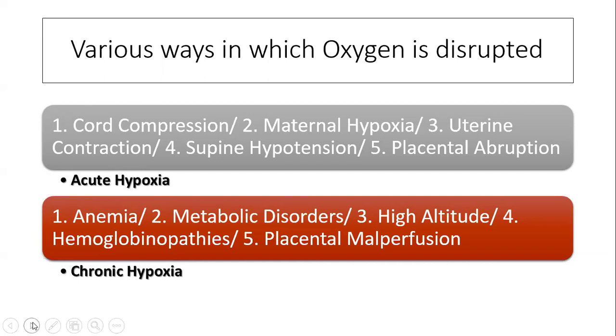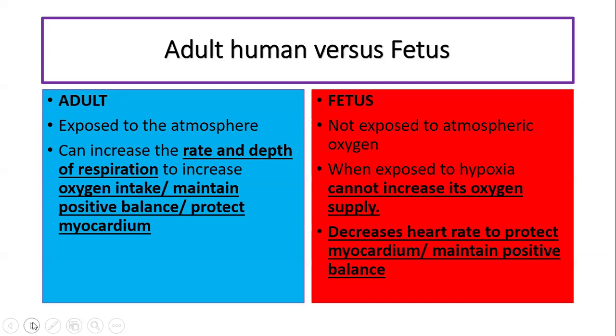And we can see this one now. Uterine artery, mid-trimester, uterine artery PIs. And subsequently, you see the manifestations in the umbilical artery PIs and blood flow. So that's the first. The second way is when the placenta becomes too old, in post-dates, and also when the baby is too big for the placenta to function. In all these cases, you have a relative uteroplacental malperfusion. So essentially, this is what we would normally see, and we see the manifestations of chronic hypoxia more during the antenatal period.